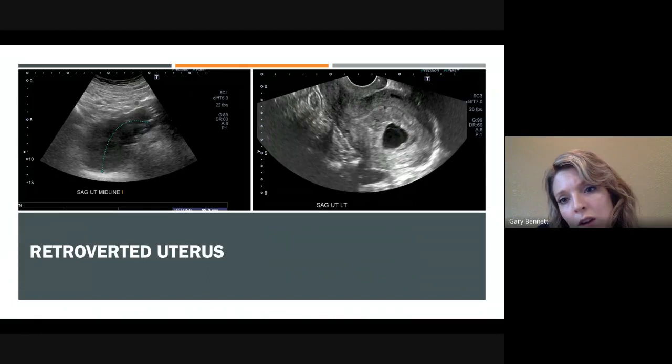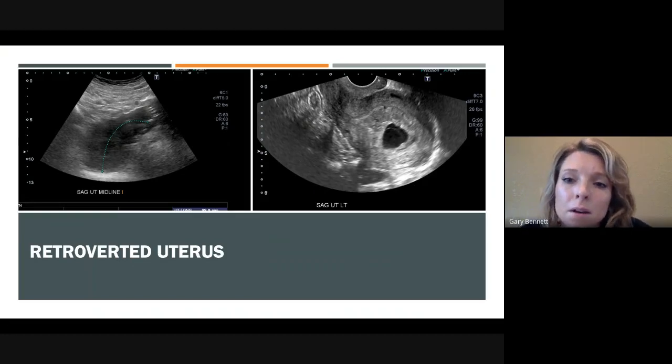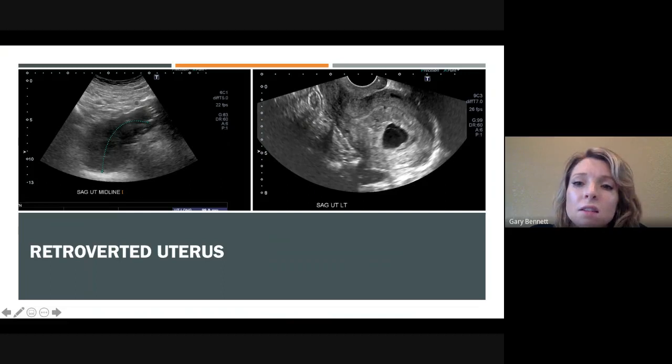See anything interesting here? This over here is not a subchorionic hemorrhage. These are just dilated vessels within the uterus, within the myometrium there. If I'm a betting person, this is a multigravida patient. After having a single pregnancy, you often develop these bigger vessels within the myometrium. Pretty common to see. Just be aware of your location when you see that.